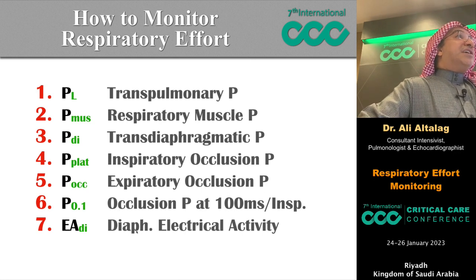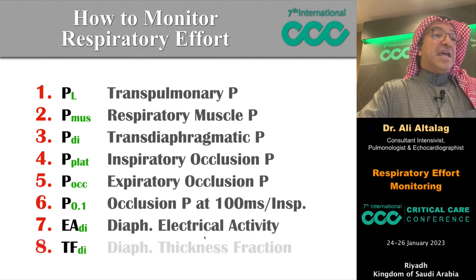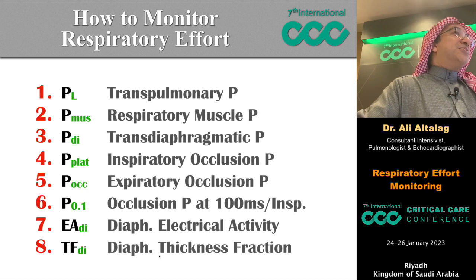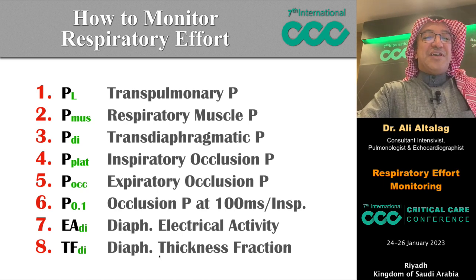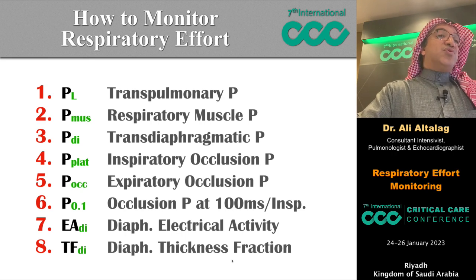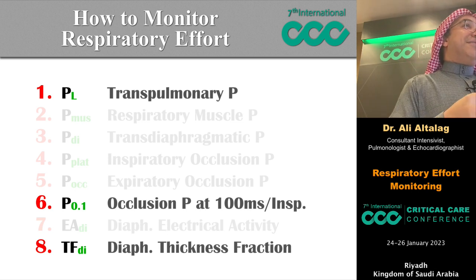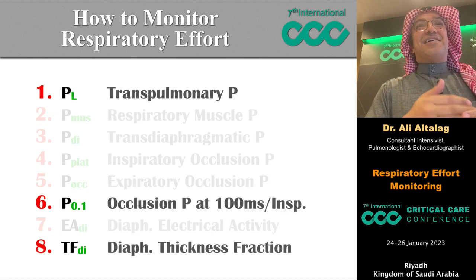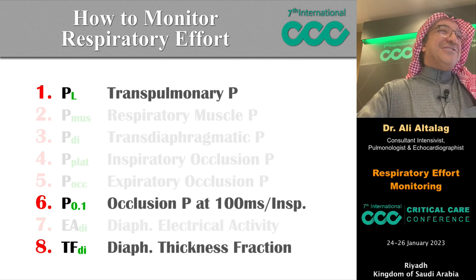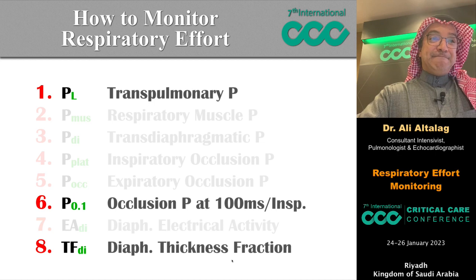Then diaphragmatic electrical activity, and I'm an ultrasound guy, so I have to talk about ultrasound too. So the use of the diaphragmatic thickening fraction with ultrasound is also useful. I had to delete several slides, and I said that to Mike, as if I'm cutting pieces of my heart when I deleted them, because otherwise I wouldn't finish the presentation. So I'll focus on these three parameters.